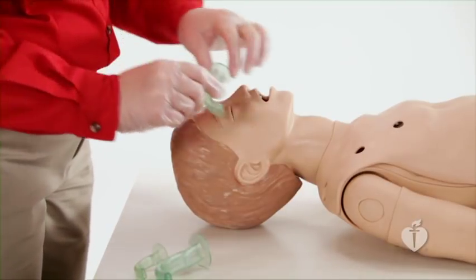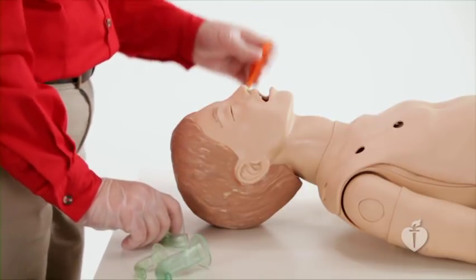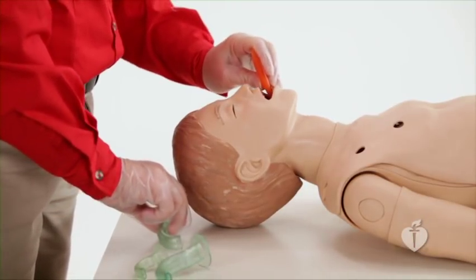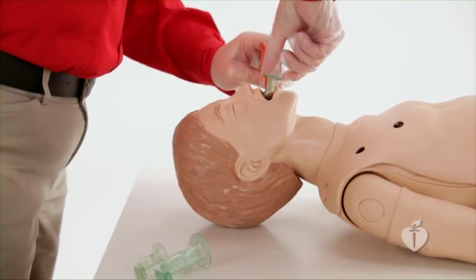This airway is the correct size for this mannequin. One technique of inserting the airway is to use a tongue blade to depress the tongue. The airway may be inserted on its side or in an inverted position and then rotated into place. Remember, the oral airway should not be used in conscious, responsive children as it may cause a gag reflex and vomiting. Effective bag mask ventilation is an essential BLS intervention that will be reviewed in this station.